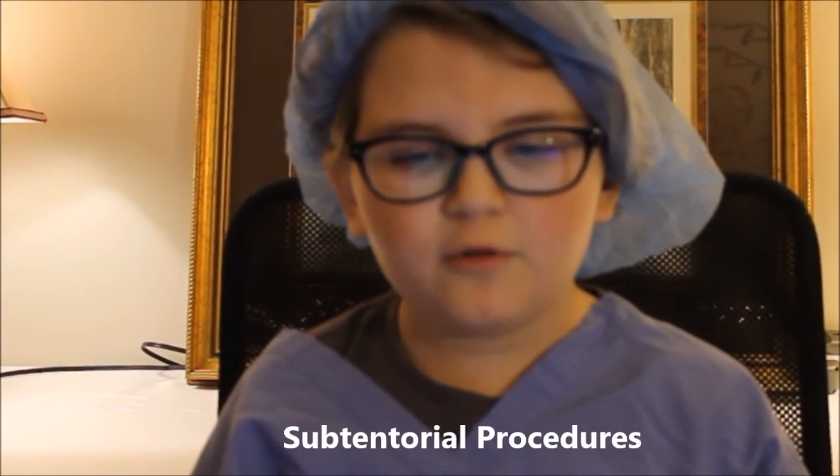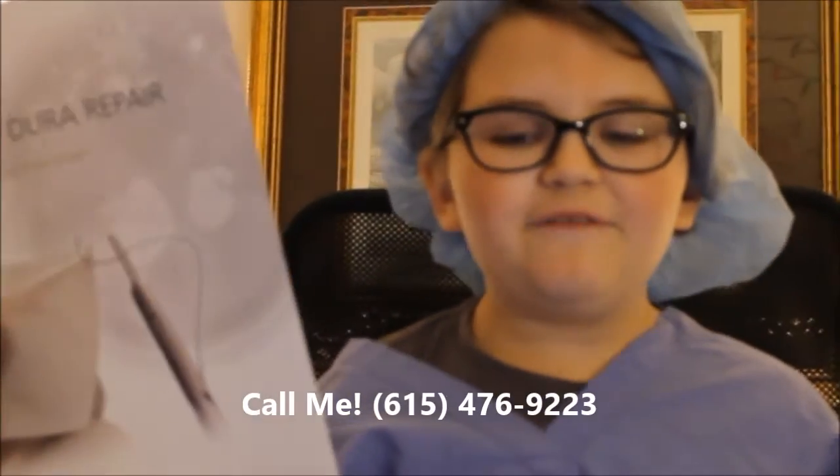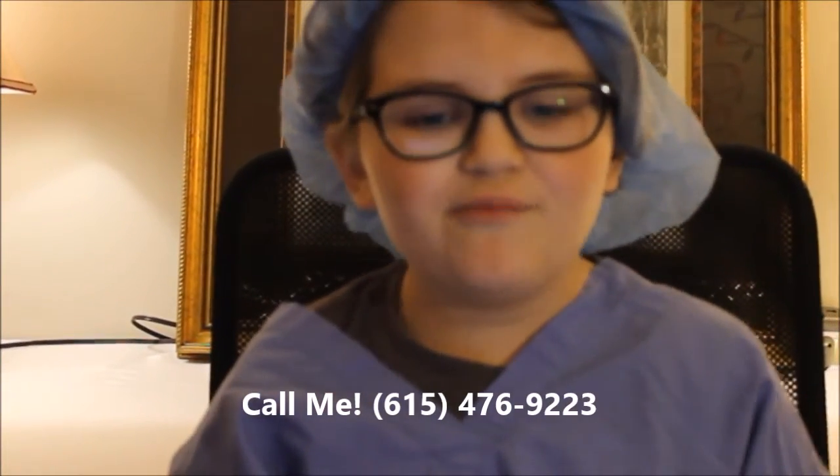Its excellent strength properties provide superior onlay characteristics for a watertight seal. Robust enough for even my subtentorial procedures. In addition, I have not had any problems going back in for revisions. Feel free to call me for a peer-to-peer if you have any questions about my experiences with this great new product.